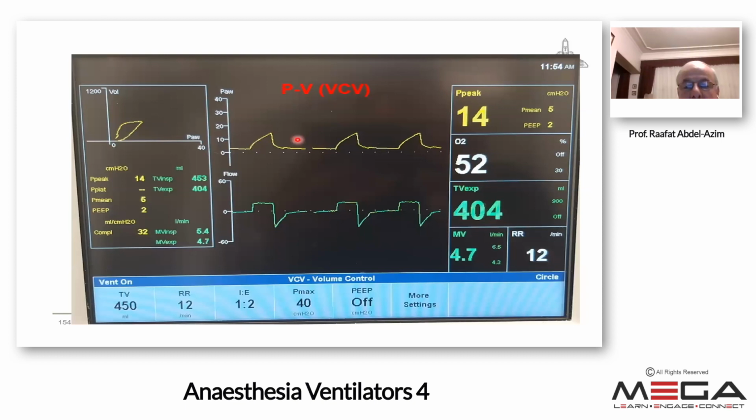This is the volume control because the pressure is peaked and because the flow is constant. And here we can know the relationship between these displayed numbers. Here are the preset values of tidal volume, respiratory rate, IE, Pmax, PEEP, and more settings. And here are the measured values.